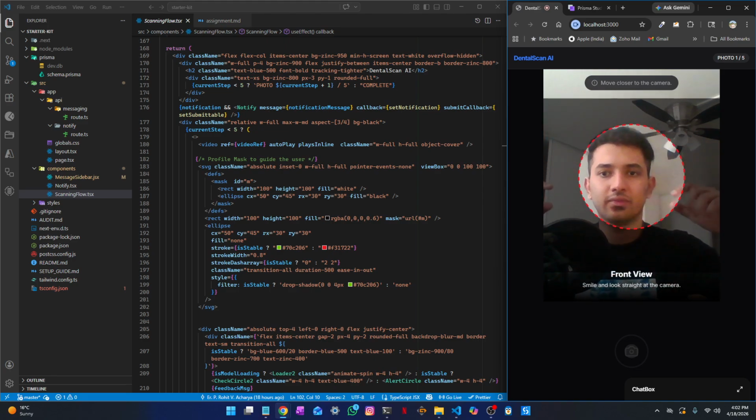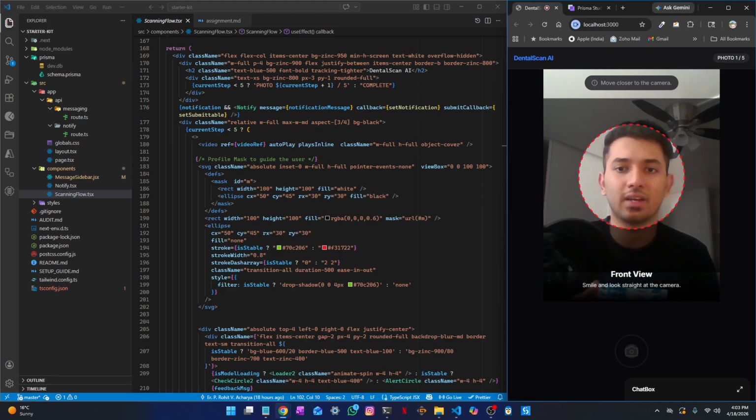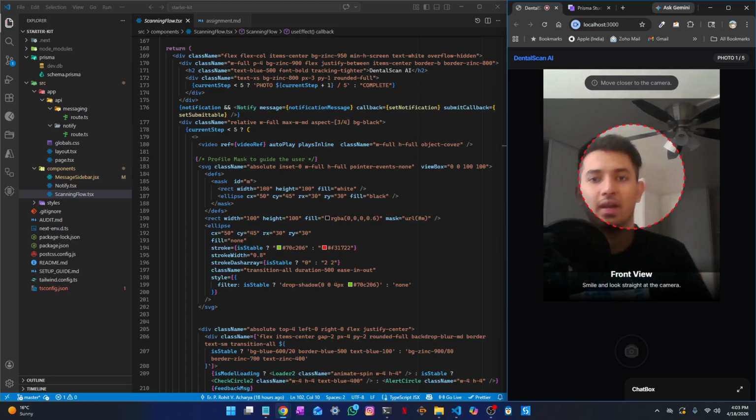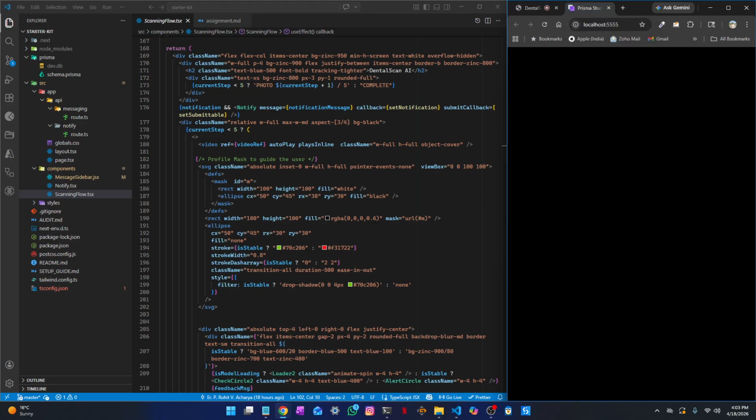just to give the user more intuition about what should happen when he or she opens the application. They just have to align their face into the center, and this is pretty much what I've done. And this is actually amazing. So I'll also show the database.